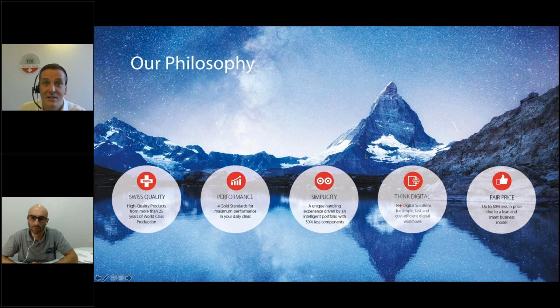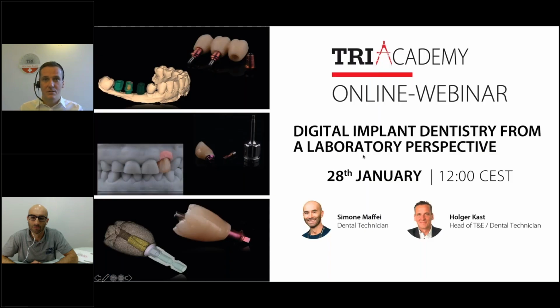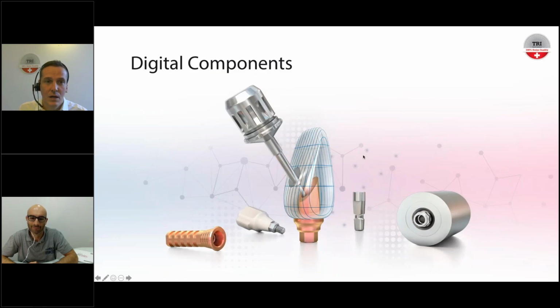Not only the dental technicians have to think digitally, also the dentists and surgeons have to really make sure that they are up to date with the digital workflows. And so I just want to show you some products of our portfolio. You can see here our digital family, with different products which you use in the digital workflow.